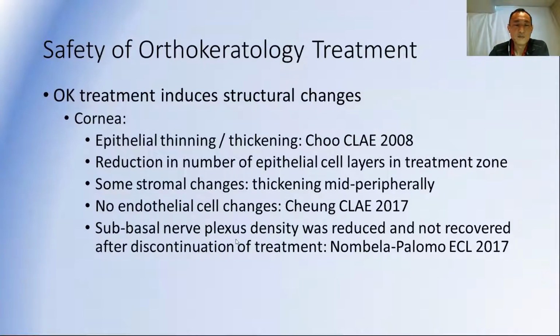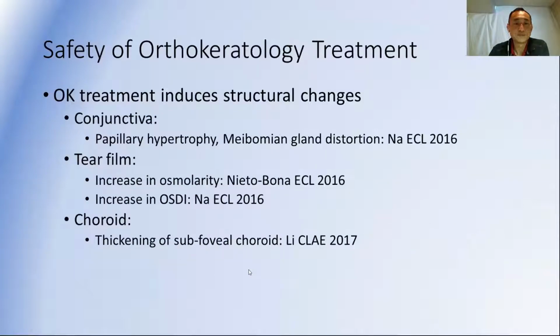And then again, nerve plexus density, we'll have to see if that becomes a significant issue. So far, in the amount of time that I've been doing Ortho-K, which is over 15 years, I haven't seen any significant problems, or at least clinical problems associated with this finding.